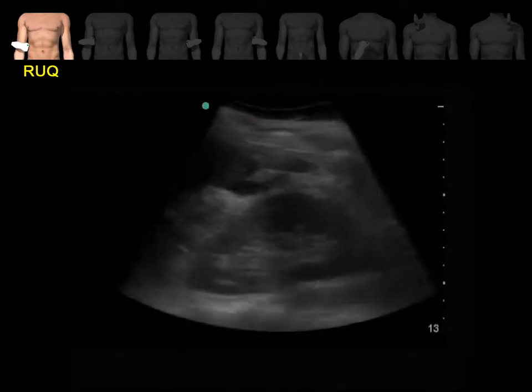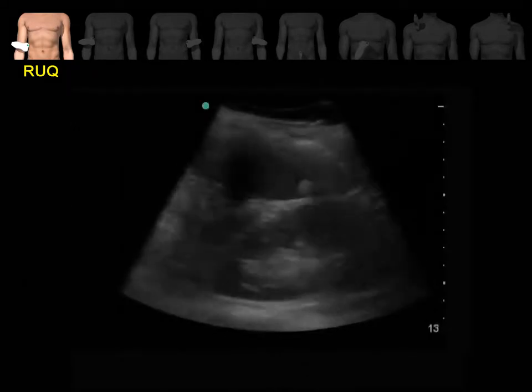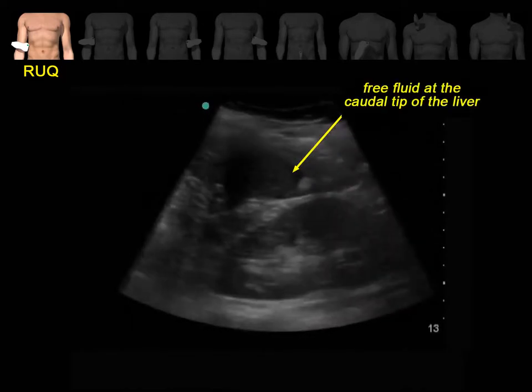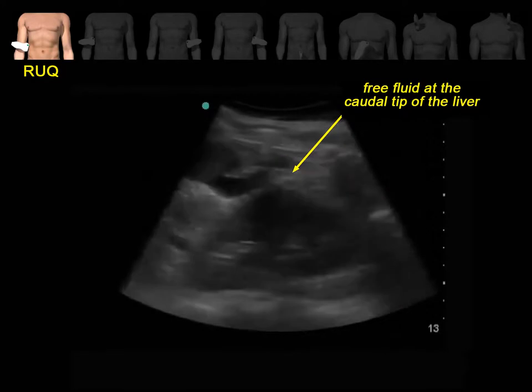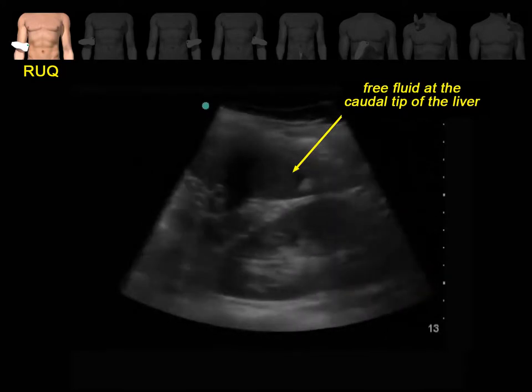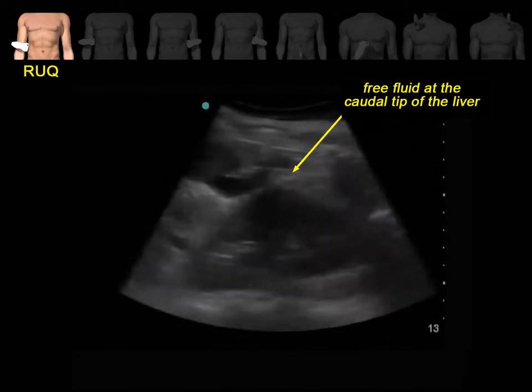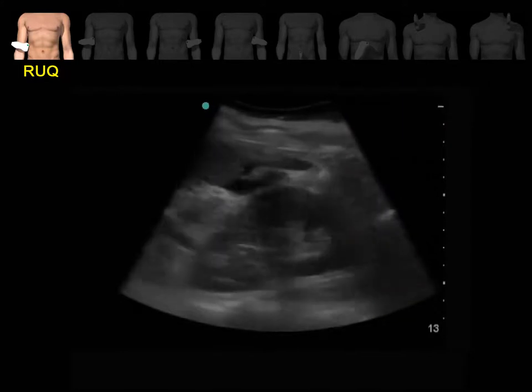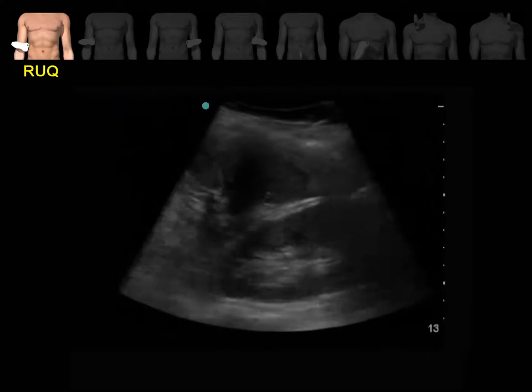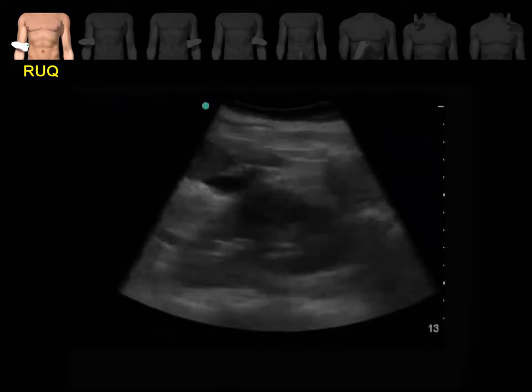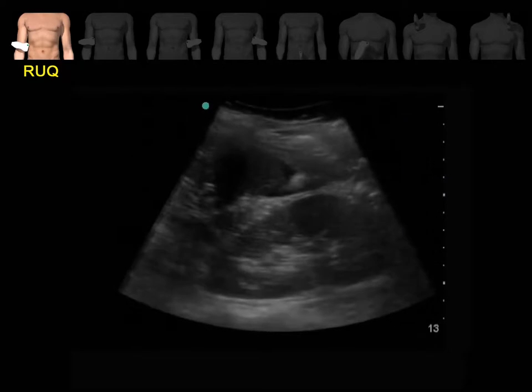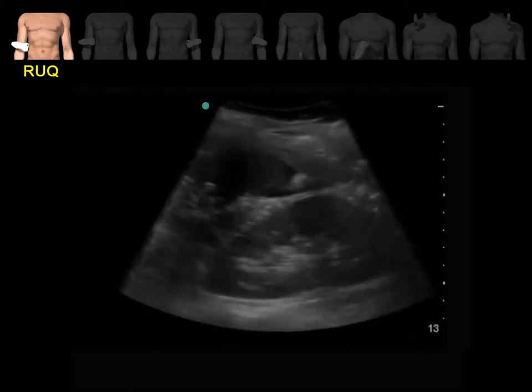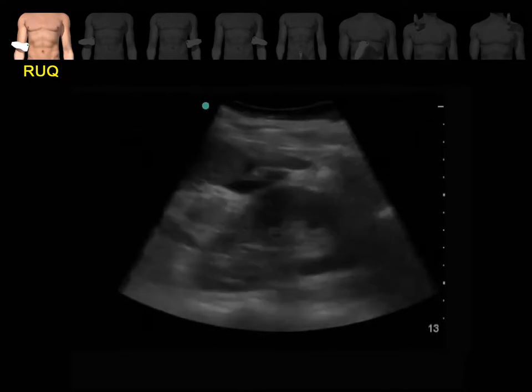This is a 26-year-old male who presented to the ED after a motor vehicle accident. You can see a small area of free fluid collection at the caudal tip of the liver. If we scan only the interface between the liver and the kidney without paying attention to the caudal tip, there is a good chance we may miss this significant finding. Always make sure you include all the areas of interest, not only the interface between the liver and the right kidney.